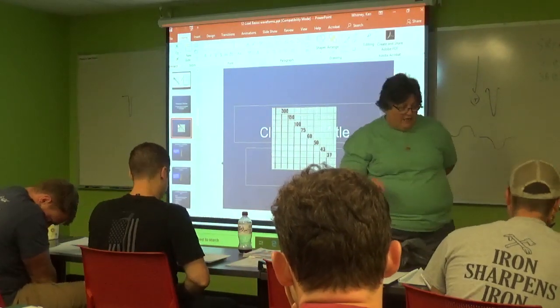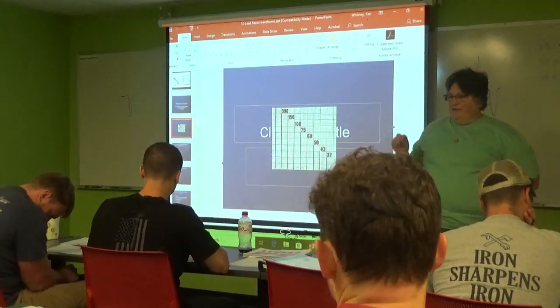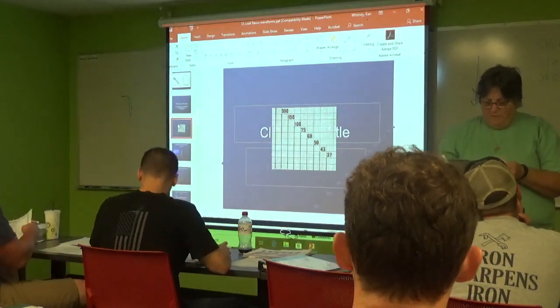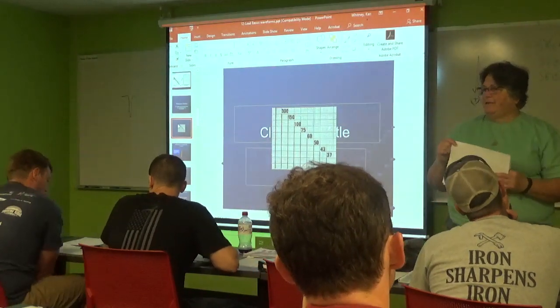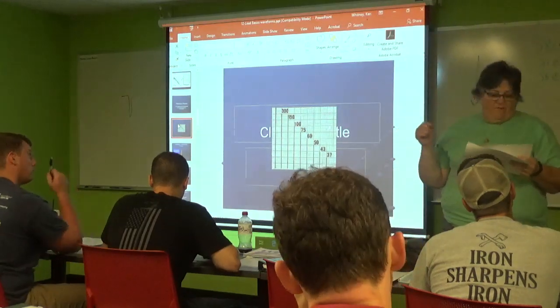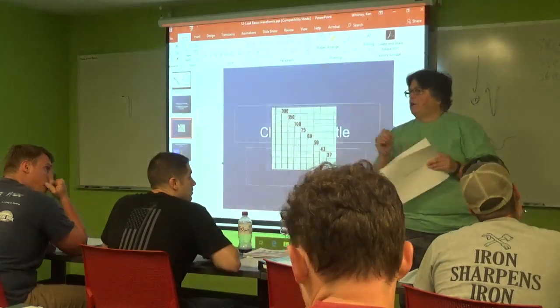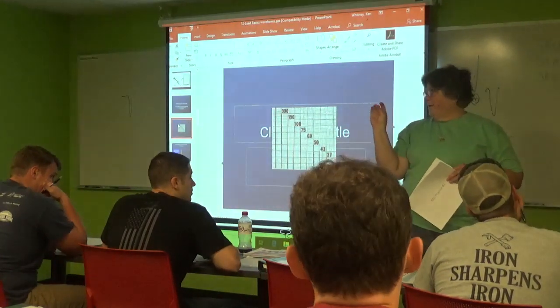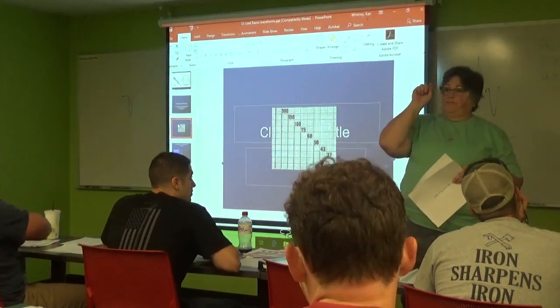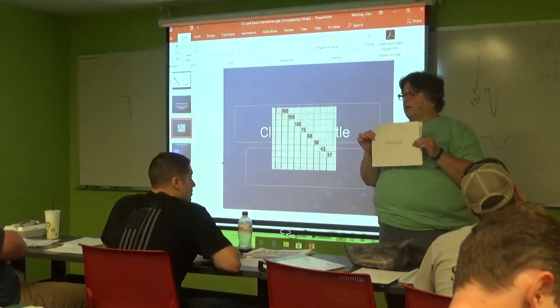On a lot of these EKGs, they're written in milliseconds, so it's three digits. If your PRI is 208, that means your PRI is 0.20, almost 0.21. If you have a QRS that is 9, then your QRS is 0.09. There has to be three numbers there, and the decimal comes in the beginning. So generally three digits, it's dot, whatever the next two are. If there's only two numbers, you have to add a zero.